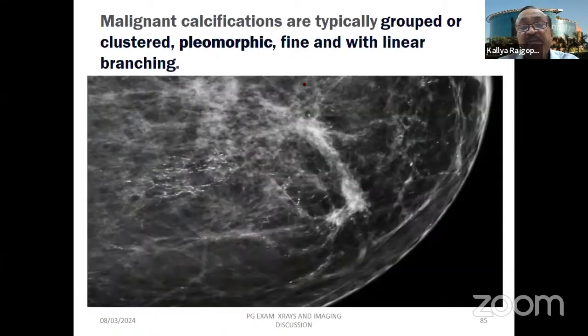Now, one of the important questions is about the calcification pattern. Just like in thyroid, we have the microcalcification, then taller than wide, and we say here also, especially the calcification pattern, pleomorphic. Like we have a pleomorphic adenoma, that's a different one, but the word pleomorphic, if you look at the calcifications, some linear, some thin, branched, narrow, wide, clustered.